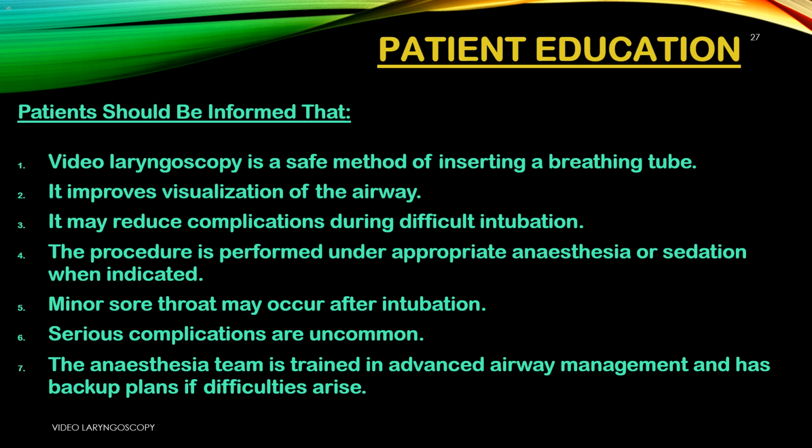4. The procedure is performed under appropriate anesthesia or sedation when indicated. You will be asleep or sedated so you don't feel discomfort during tube placement. 5. Minor sore throat may occur after intubation. A bit of throat irritation is common and goes away in a day or two. It's normal after having a tube.